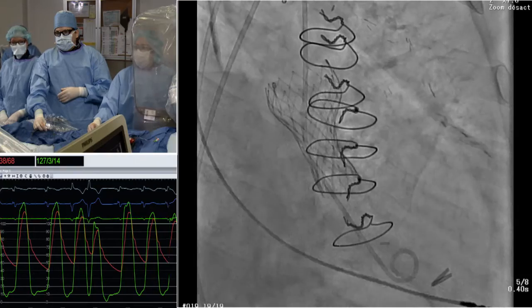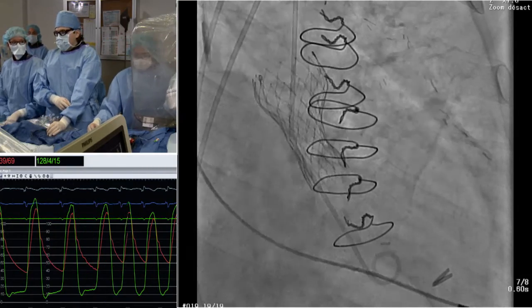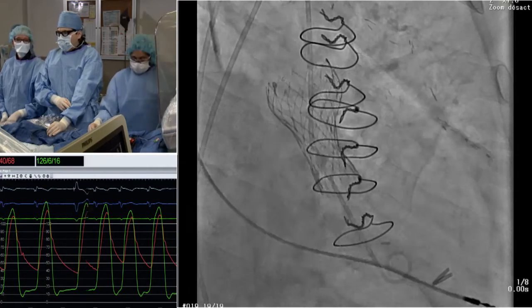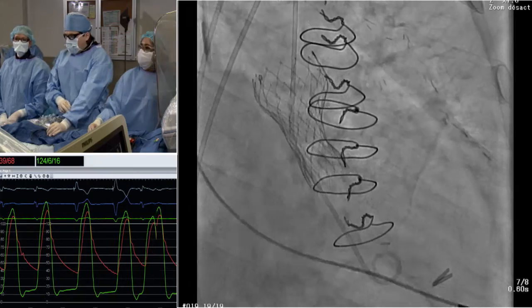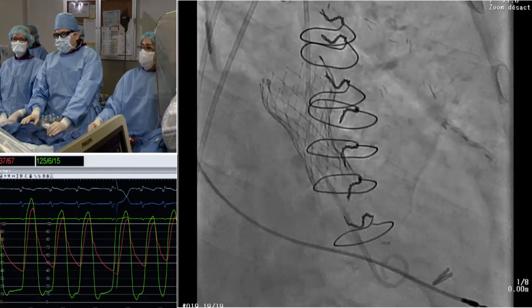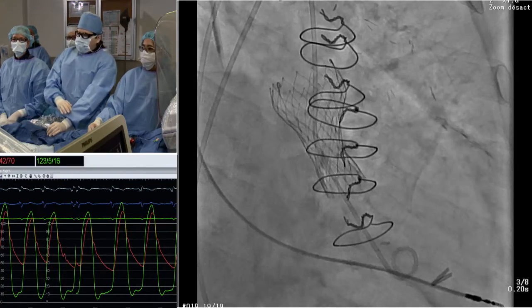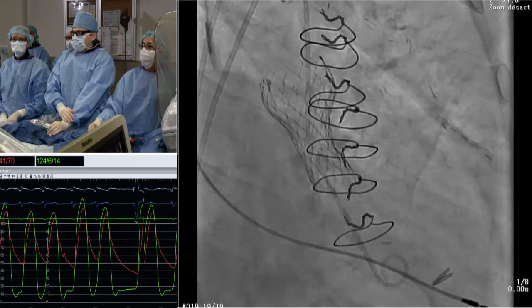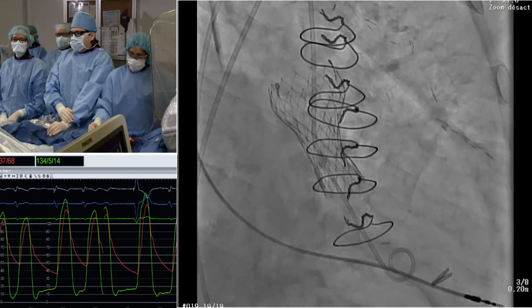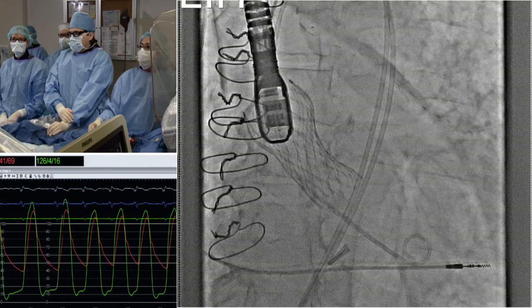Yeah, Nico. What's the downside to post-dilate here in your mind? We don't have any at the moment. There's been studies looking at whatever long-term durability we have, or the acute results after post-dilatation, and we don't have any untoward effects other than potentially increasing the risk of stroke and pacemakers. Well, the other concern is anatomical. If your valve is already very high, and now you're post-dilating, you have some concern about pop-out.